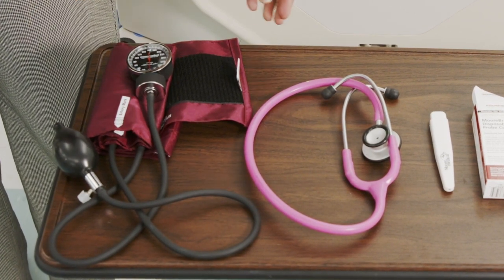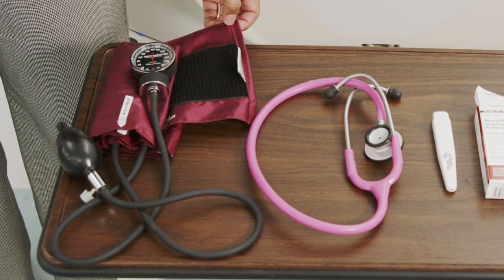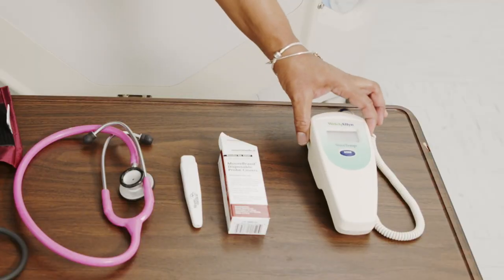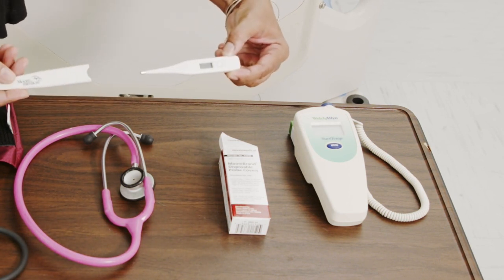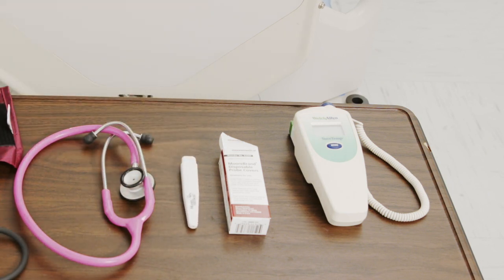You will need a blood pressure cuff that is the appropriate size for the circumference of the patient's arm. You will also need a stethoscope to take the blood pressure. To take an oral temperature, you will need an oral thermometer. Here are two different types of thermometers, and with each of the oral thermometers, a probe cover is used when taking the temperature.